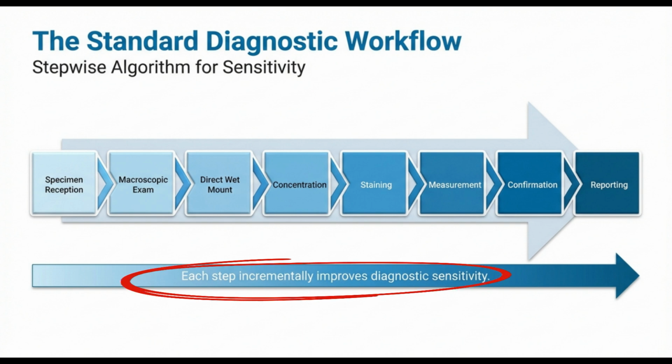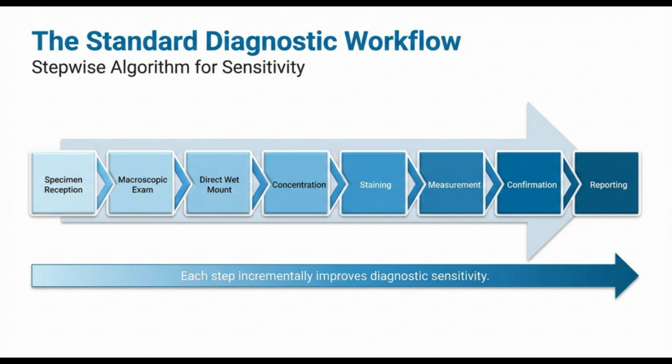But you see that arrow at the bottom? That's the key takeaway here. Every single step incrementally improves our diagnostic sensitivity. You can't just jump ahead because each step builds on the one before it.